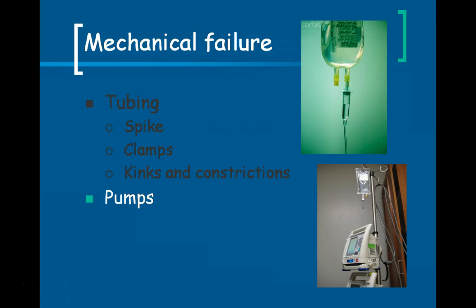But pumps are only as sensitive as we set them to be. And if we set them to be too sensitive to pick up problems, then the alarm is going off constantly, and we get what's called alarm fatigue, where we tend to not look at pump alarms as urgently as we would otherwise. So we'll look at pumps later.